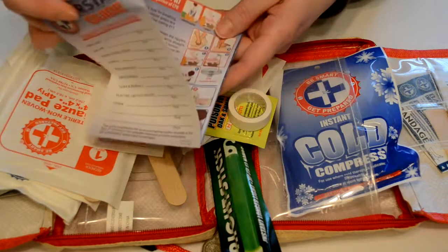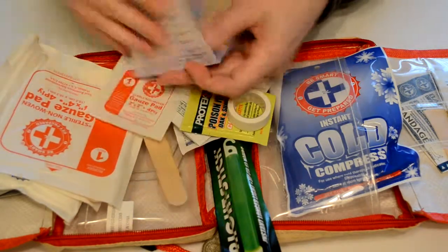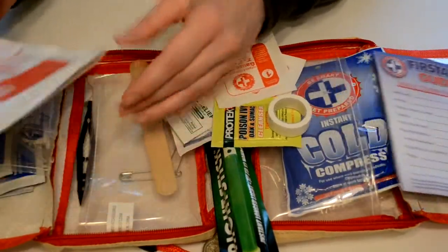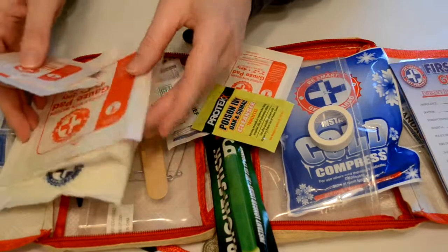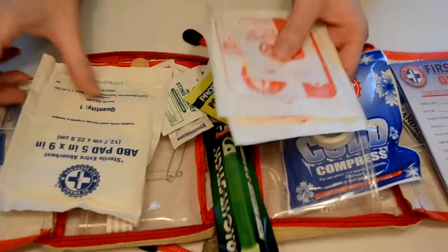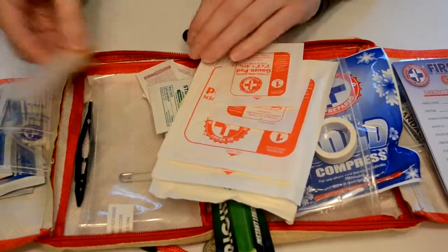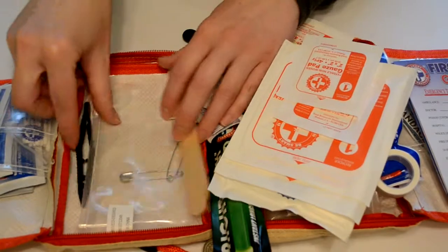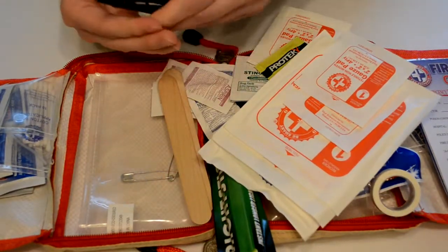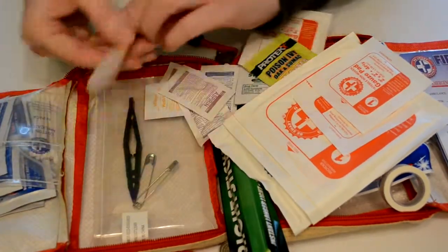Wherever we are we can write down some numbers for emergencies, and it's got some instructions on how to use some of this stuff in here. We've got different sized gauze pads — small and large — and a sterile absorbent pad that's a little bit bigger for bigger emergencies. We've got tongue depressors and some forceps, or tweezers as some people call them.